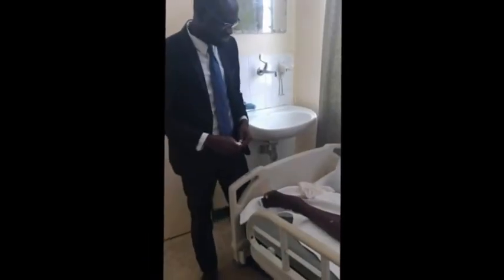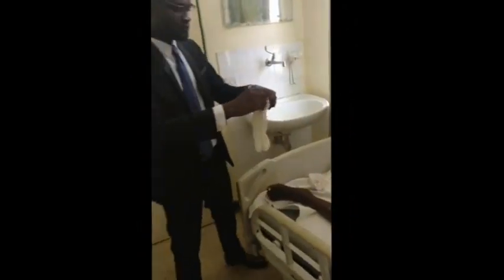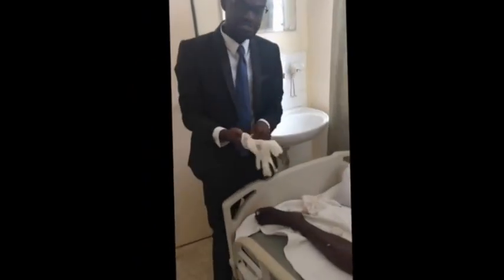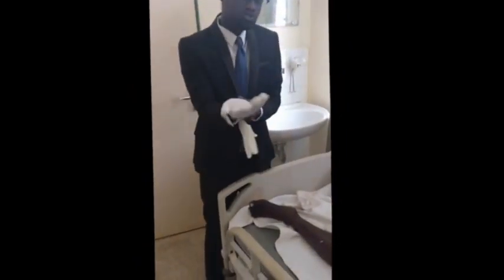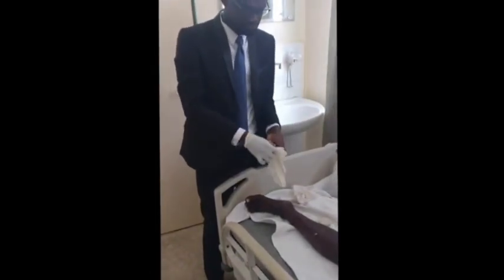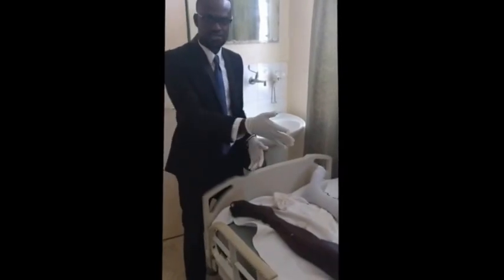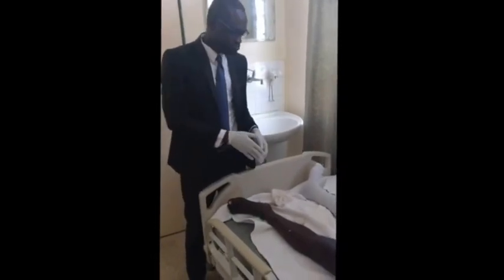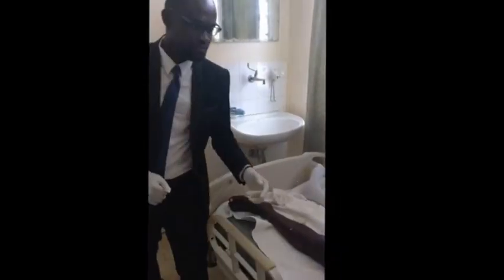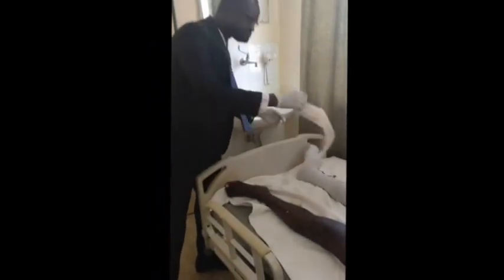Once the stockings are in, I need to don my gloves to facilitate easy wearing of the stockings. So I wear my gloves. I tell the patient I'm going to put the stockings on. So the patient has agreed.